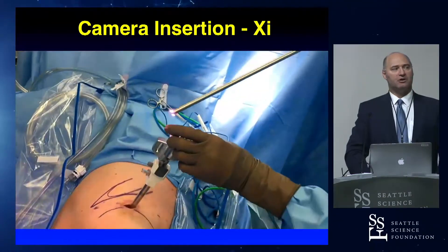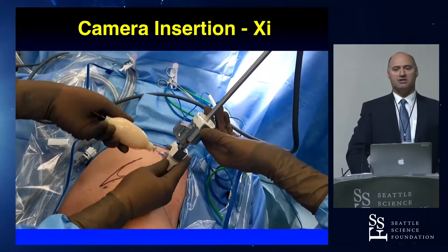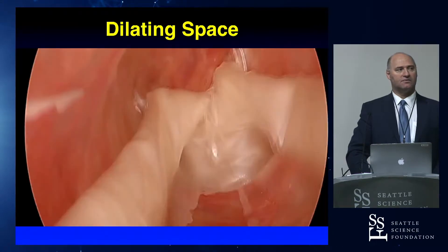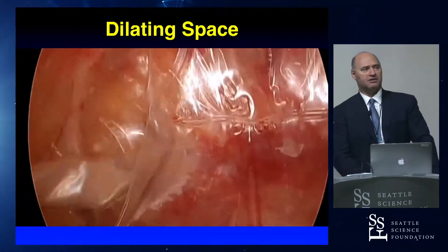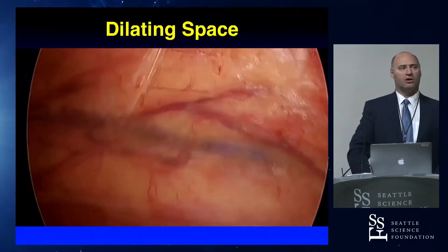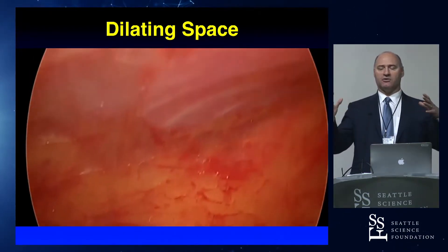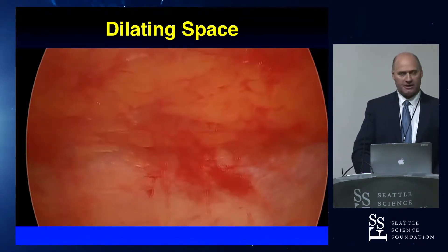This is a 10-millimeter balloon and we have an 8-millimeter XI scope. We just put a robotic XI port inside the balloon — it creates a seal and then you can expand the balloon. When the balloon unfurls, my assistant is pumping and usually counting. It's usually between 50 and 60 pumps, sometimes more. If you're not sure how much to expand, you want to get all the folds out of the balloon. Once you expand it enough, all those folds go away and you know you have enough expansion.